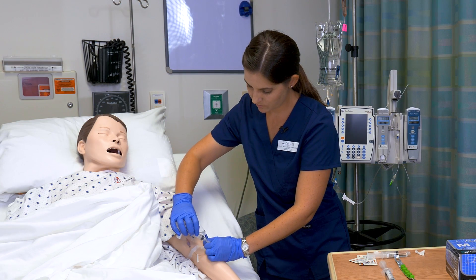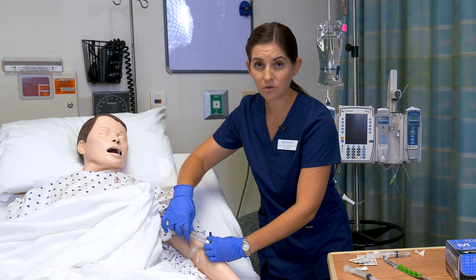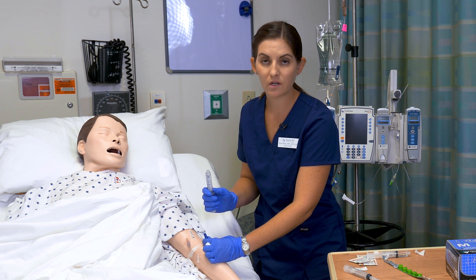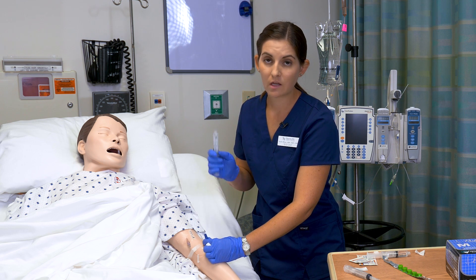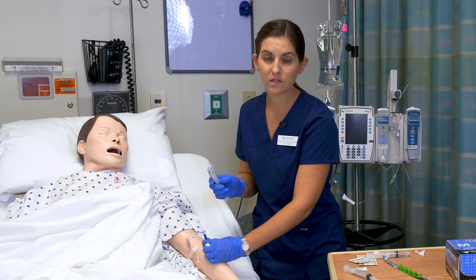I'll remove my medication syringe. I then need to flush the medication through the rest of the IV. The first mL of this flush needs to be given at the same rate as my medication — I just gave one mL over one minute, so this first mL needs to go over one minute. The rest of the five mLs can go at any rate.